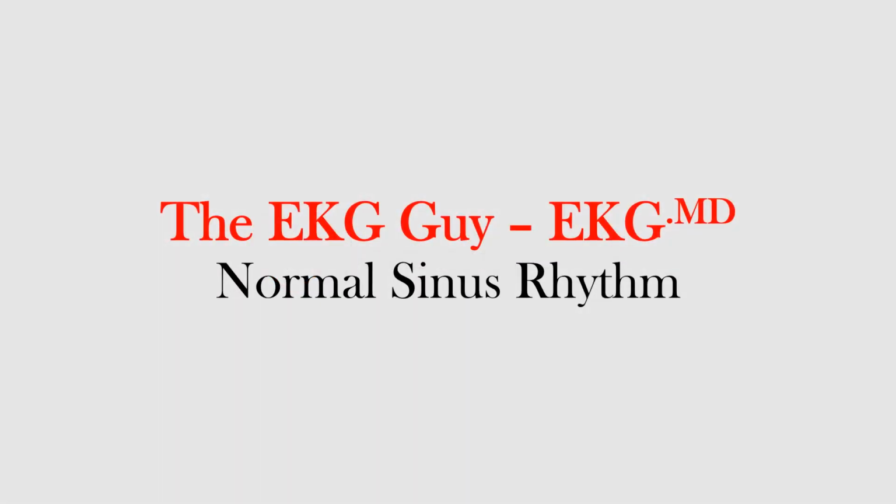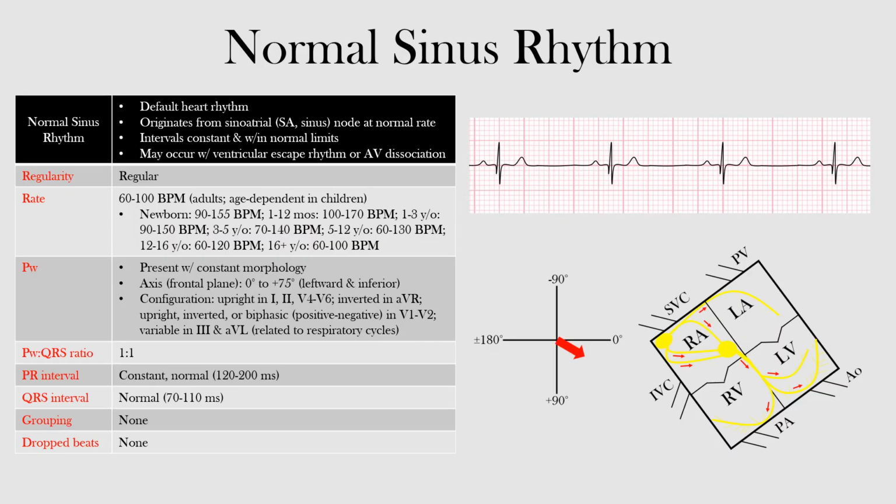In this lecture, we will discuss normal sinus rhythm and how it would appear on the EKG. Normal sinus rhythm is considered the default rhythm of the heart. Just as the name implies, sinus rhythm starts at the sinoatrial node, or SA node. You may also hear it referred to as the sinus node.